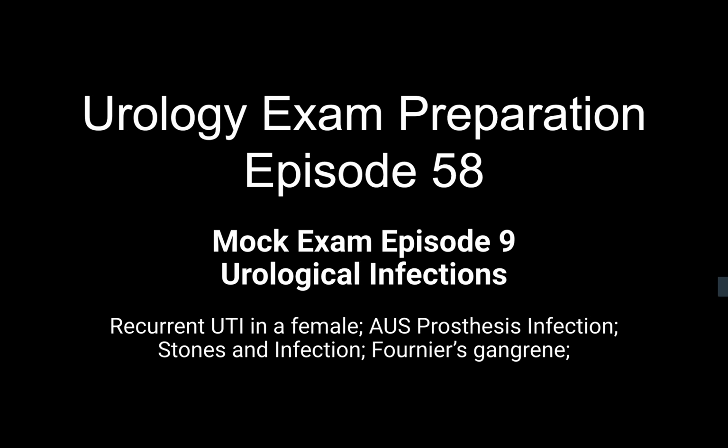Malleable is cylindrical implants which are inserted in the corpora. It's relatively easy to use. It's uncomplicated. The difference between the inflatable and malleable is that the patient doesn't have to inflate it by themselves, but the disadvantage is it has a semi-erect position compared to the inflatable implants. What is the surgery you are planning for this patient?